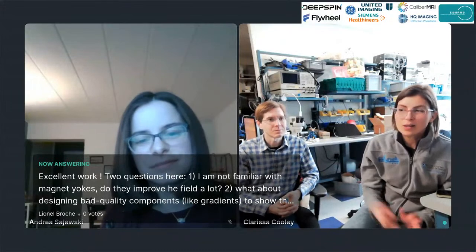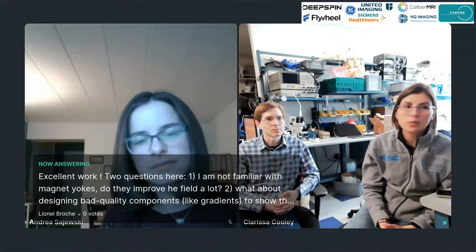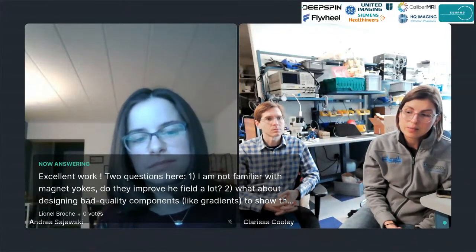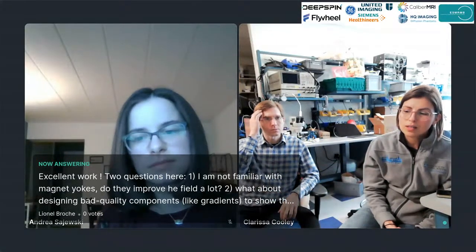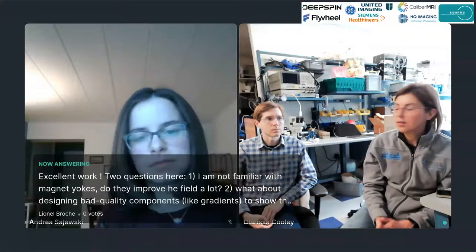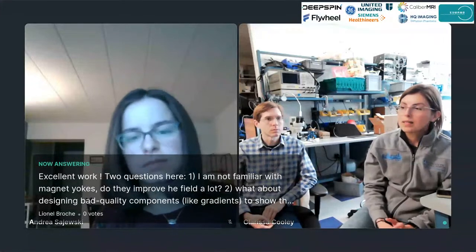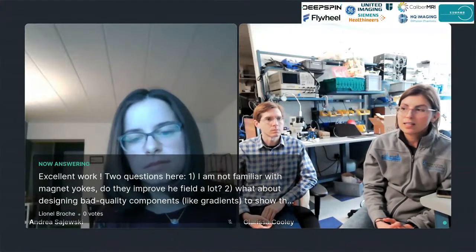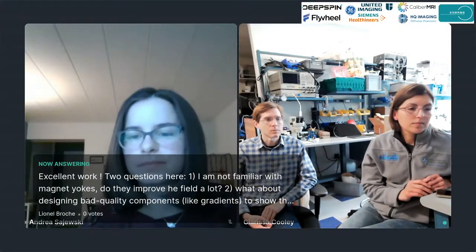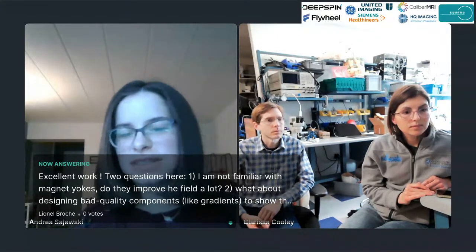There are 20 of these magnets, and a couple of them, I'm not sure why, had the shim off a bit, so they saw some of that, and the limits of what you could do with just B0 shimming to improve that. But yeah, I think that's a good idea, maybe for a more advanced topic for students. That would definitely be really interesting.